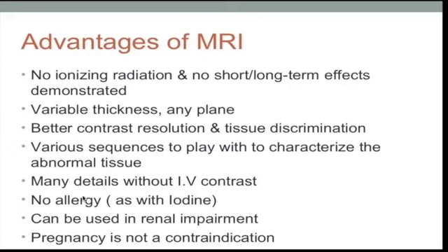And because we're not using contrast, it means that we're not going to see any allergies or pseudo allergies, and we're not concerned about the renal function. And also, pregnancy is not a contraindication.